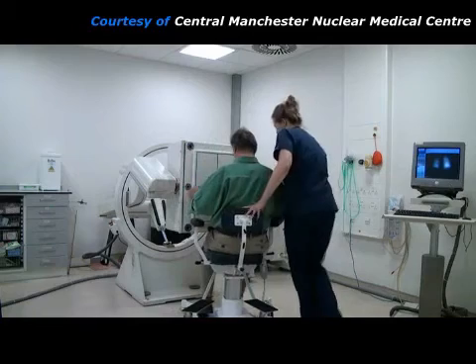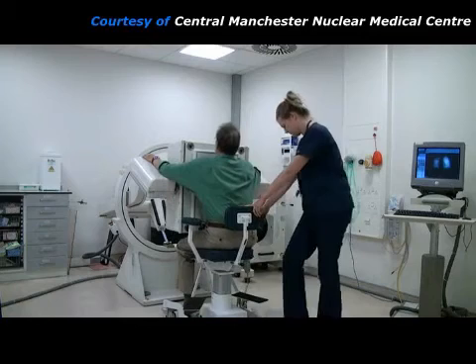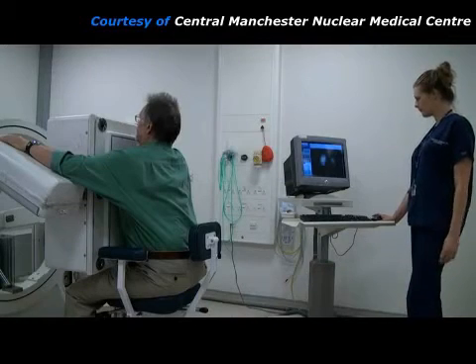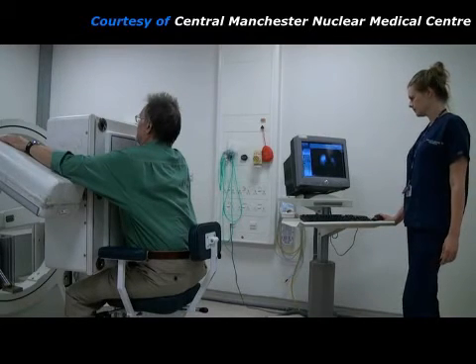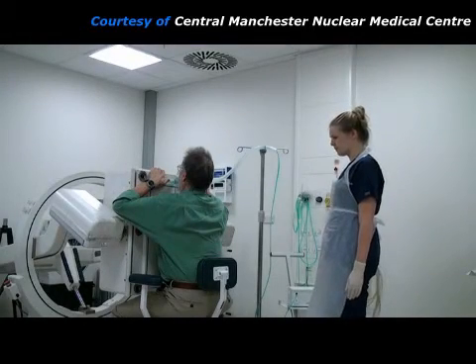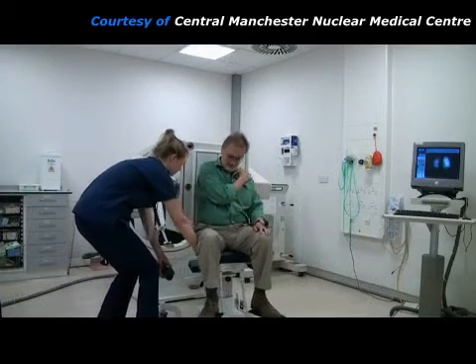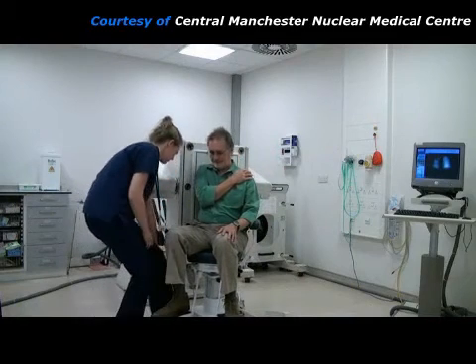Now the practitioner repositions the patient so that he is facing the gamma camera. Each picture only takes two or three minutes to acquire. Here the anterior perfusion picture is being taken. Then the practitioner positions the patient for an oblique view from his right hand side, and she acquires perfusion and ventilation pictures from this view.